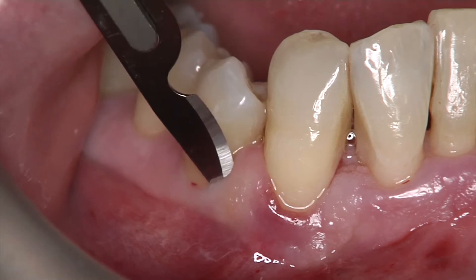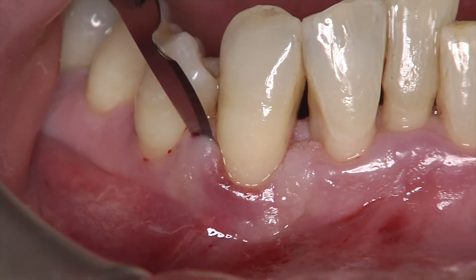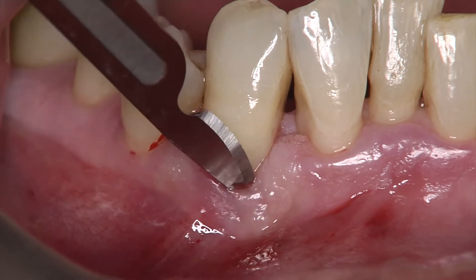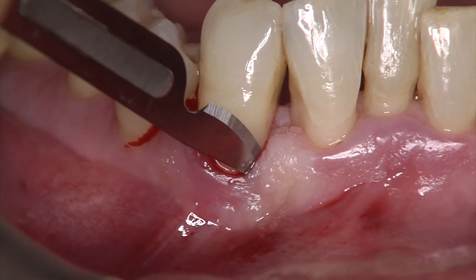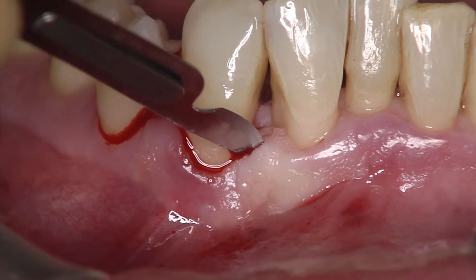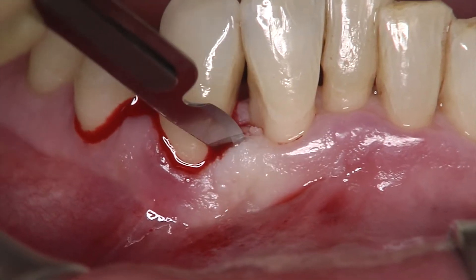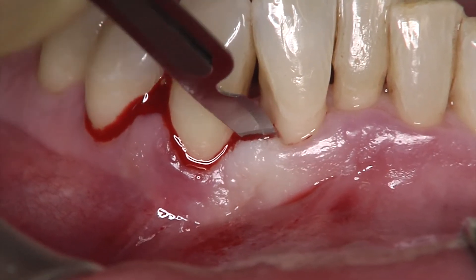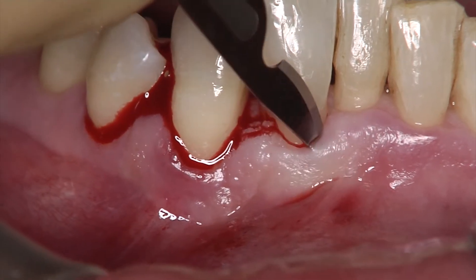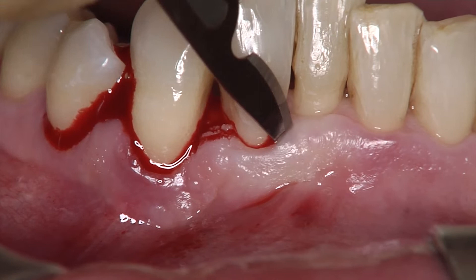The flap design is based on an intrasulcular incision following the buccal gingival margin, and a butt joint incision at the base of the papilla at the site of the intra-bony defect. The mesiodistal extension of the incision is determined by the ability to access the defect to perform accurate root and defect debridement.